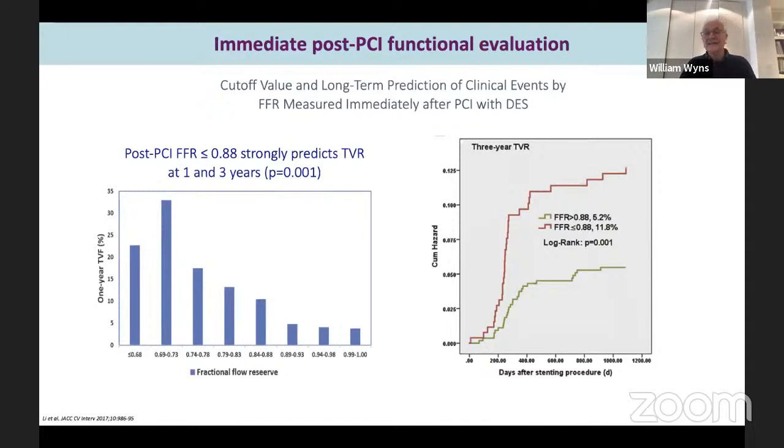And in that series, they have even shown difference in mortality. It's the only study that shows that. So remember, it's nice to do complicated formulas to calculate A versus B, but what matters for the patient is you consider the entire vessel, okay? And you do your best with that vessel to increase the conductance as close as possible to normal volume.